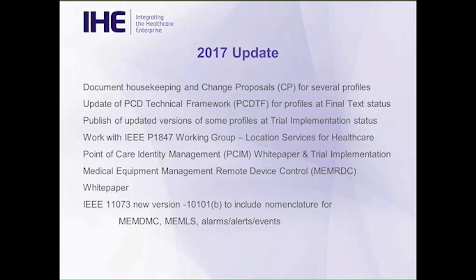The information may arrive in the Rosetta Terminology Mapping Maintenance System, RTMMS, that is hosted by NIST, before it winds up in a balloted standard, but that's our means of communicating the information such that it can be utilized by vendors and by the testing tools that NIST creates for connectathons and demonstrations.